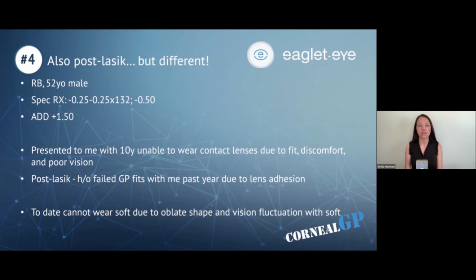What that allows us to do is free up our intellect and our time to spend on really getting to know patients. So, what are their visual goals? What are the things that they've tried that they have not been happy with? What are their dreams for the future for their vision and their contact lenses? And then also having more chair time in the short time that we have to spend with patients to think about complication management and prevention, things like that. So I have two cases to share, cases where we utilize digital design using ESP to get to a first lens fit.